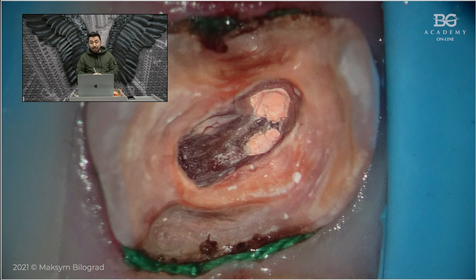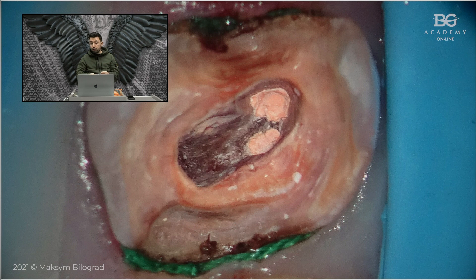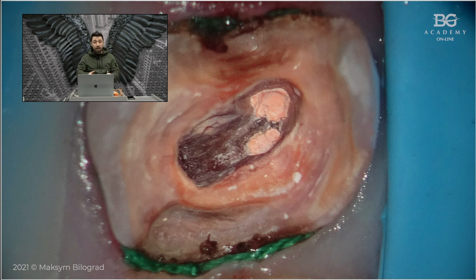The first step I did was make isolation. I used split dam because split dam isolation helps to get really nice conditions and to block the mouth cavity — no breathing, no saliva, etc. I also have access to soft tissues. In this case we had pretty deep defects from the mesial and distal side, so I can work with my electrosurgery, provide retraction, and prep this tooth using split dam, which gives extra access to the tooth because of the retraction of soft tissues.